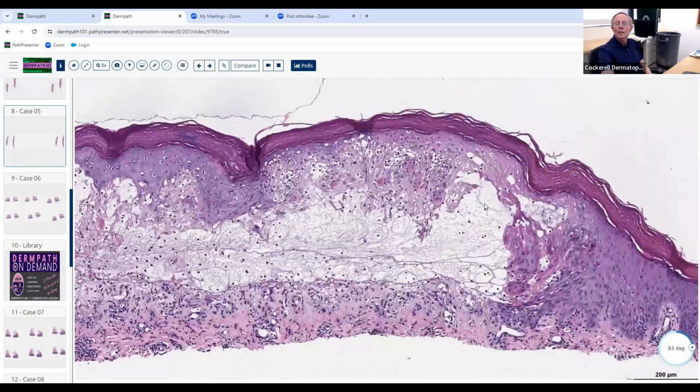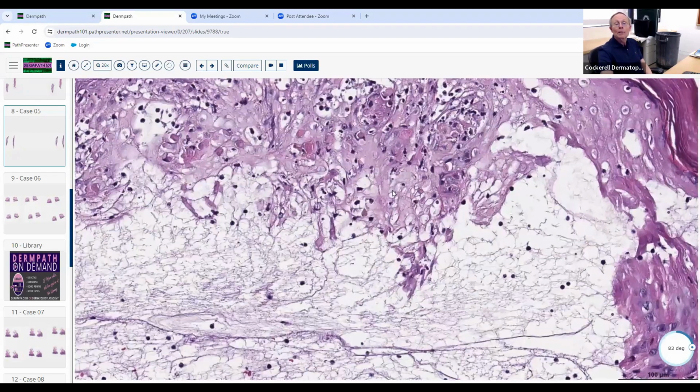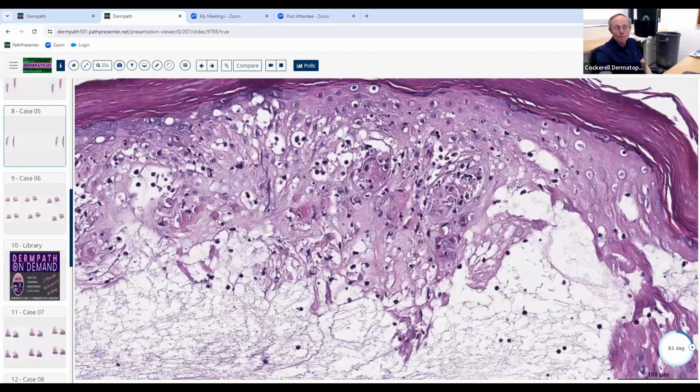So just recognize, think ballooning, think virus. It doesn't mean virus every time. In fact, the next slide I'll show you is an example where it isn't virus. But when you see ballooning, think virus and look for the pink inclusions. So this is pink inclusions of Coxsackie virus here. They look similar.